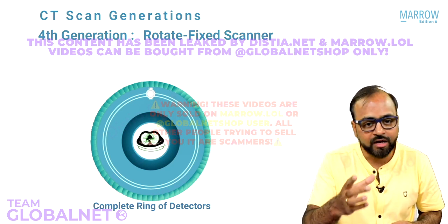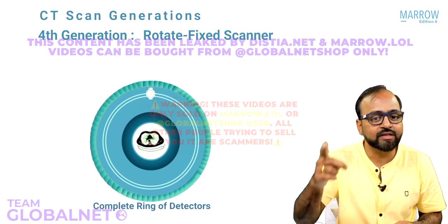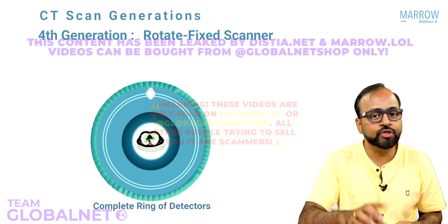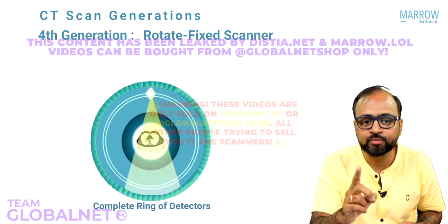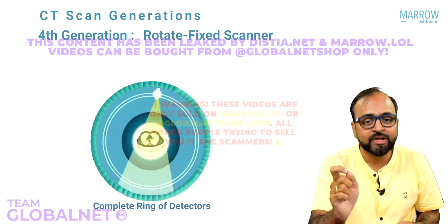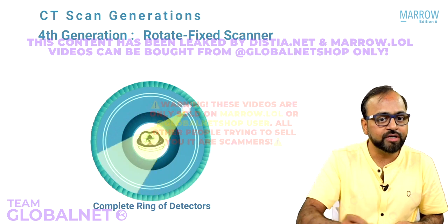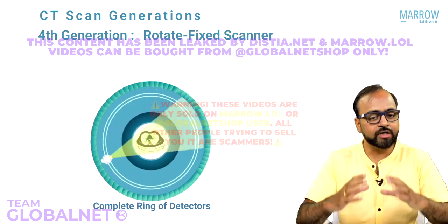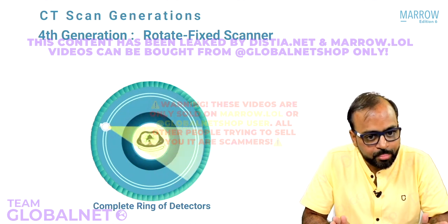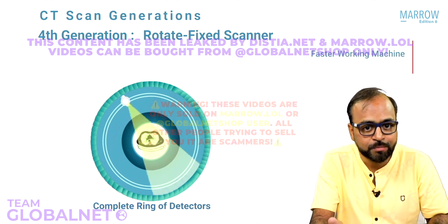Here in this machine, around the patient, there is a complete 360-degree ring of detectors everywhere around the patient's body. So only one component of the CT scan machine is now rotating, and that is the X-ray tube. So look at the animation. The X-ray tube is rotating round and round around the patient's body, but the complete 360-degree detector ring is absolutely stationary. Hence the name is rotate fixed. This is an even faster working machine.